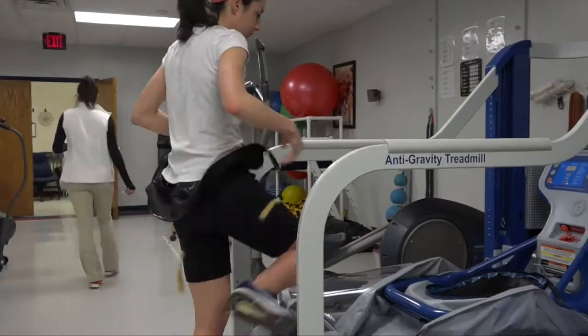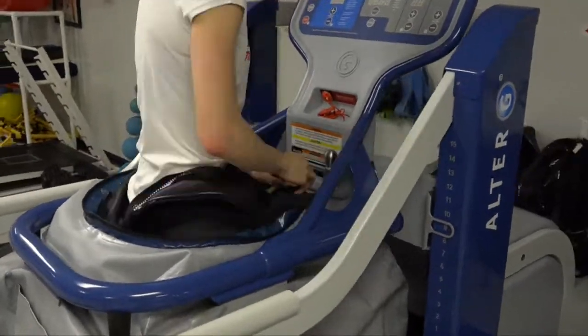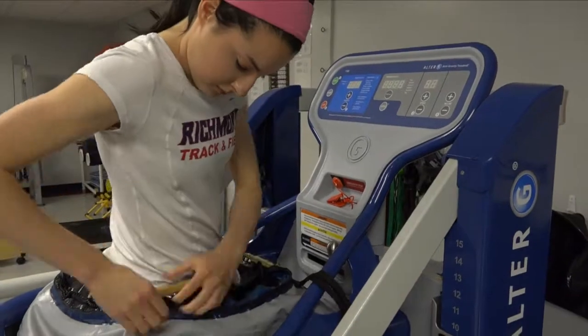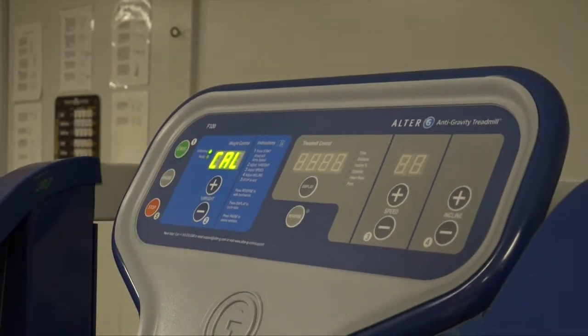This treadmill was actually designed by a biomechanist with NASA. What will happen is this will fill up with air and change the air pressure. They can set their weight anywhere from 20% to 100%, and as it fills up with air, it actually kind of lifts them up to change their weight.